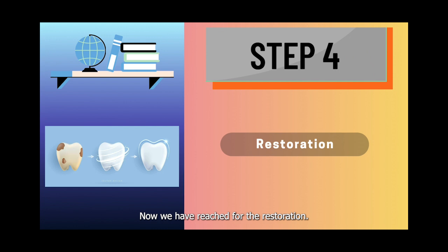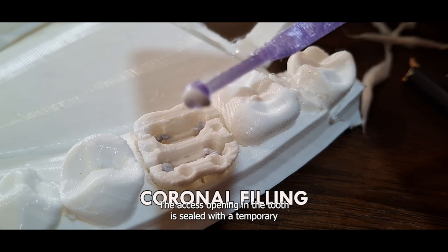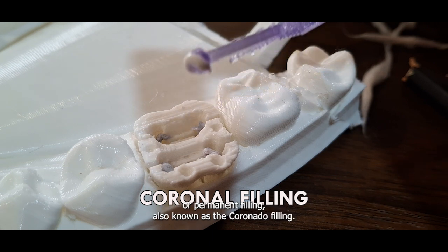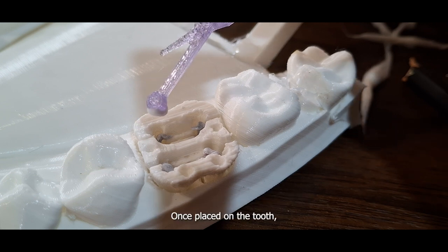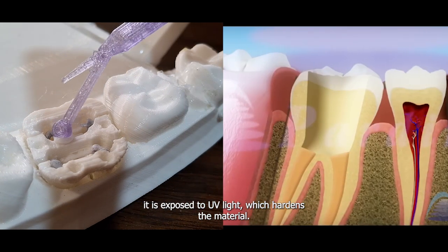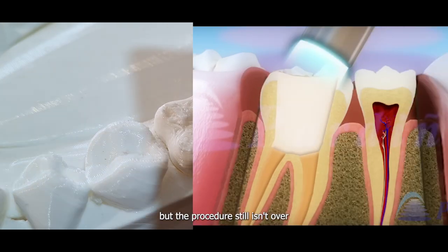Now we have reached step 4, the restoration. After the canals are filled, the access opening in the tooth is sealed with a temporary or permanent filling, also known as the coronal filling. Once placed on the tooth, it is exposed to UV light, which hardens the material. This procedure is repeated until the tooth shape has been restored. But the procedure still isn't over.